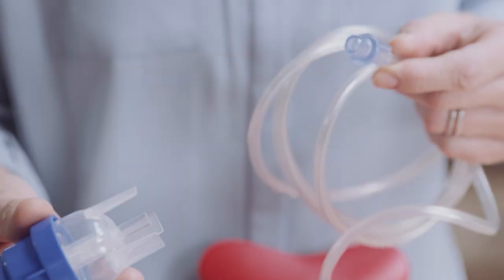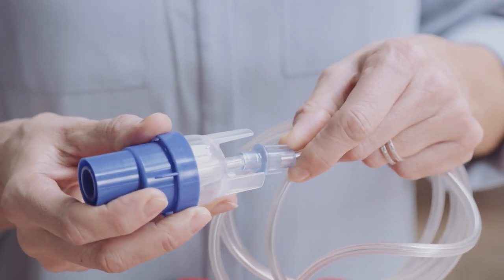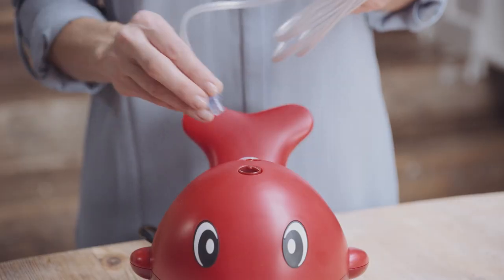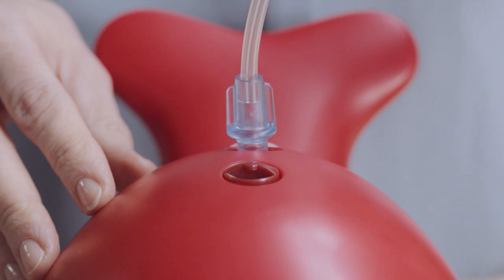Assemble the Sidestream nebuliser cup and air tubing together as shown. Attach the other end of the tubing to the air outlet on the compressor. Both ends of the tubing are the same.